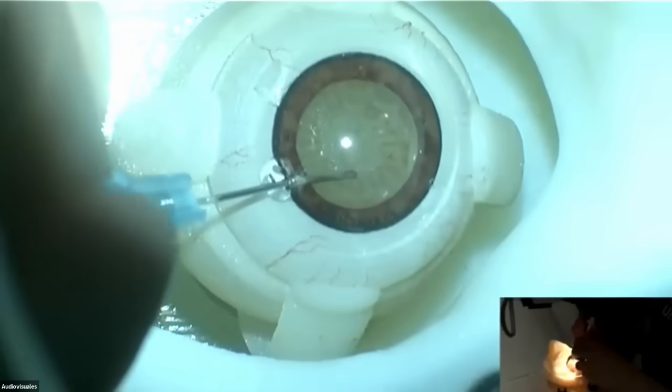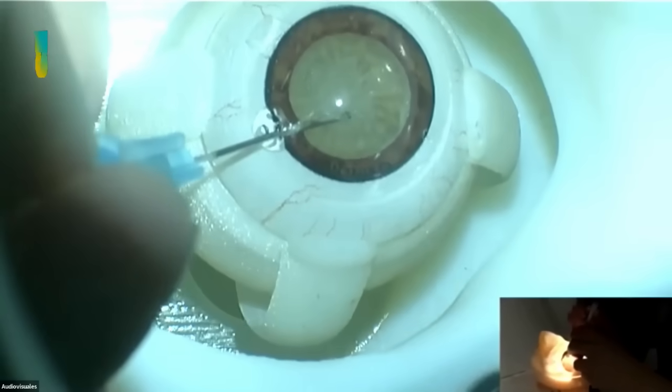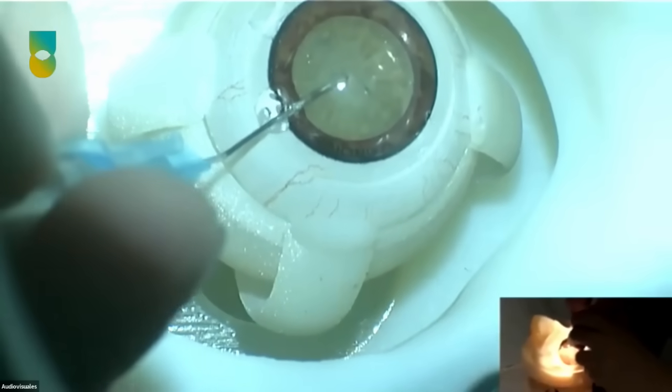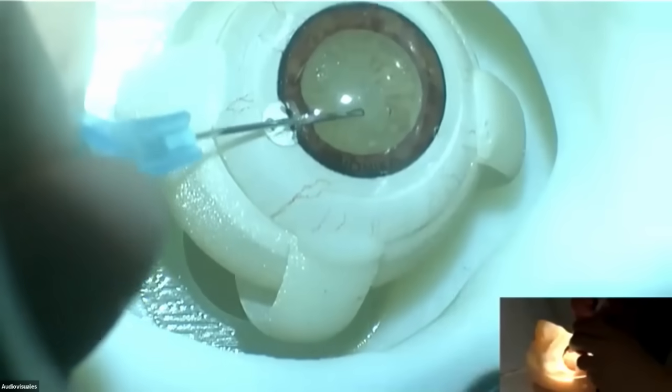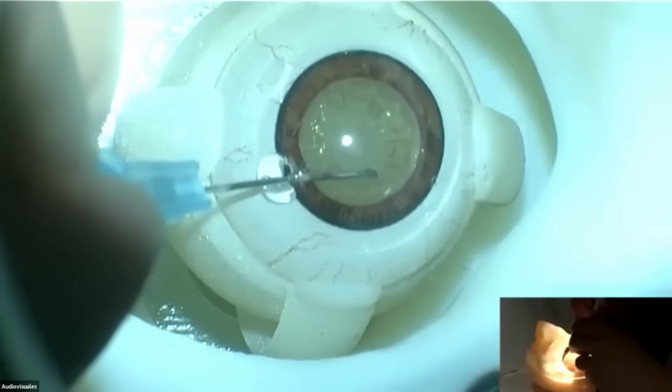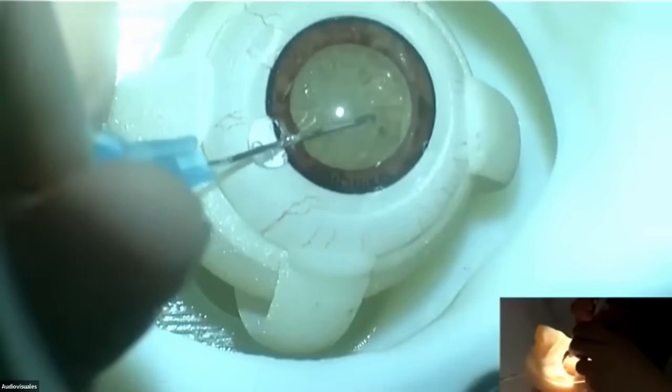So I often do my capsulorhexis with two hands, on my cystotome and on the Utrata. But then if the patient's moving or I'm afraid that they're going to move, I'll actually just do it one-handed, and I'll hold with my second hand with a forceps on the conjunctiva to stabilize the eye.